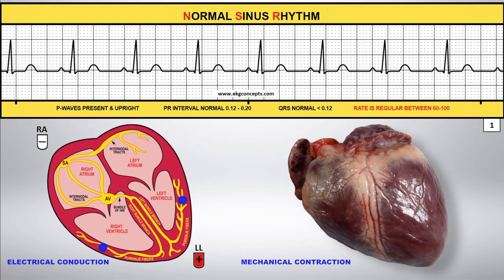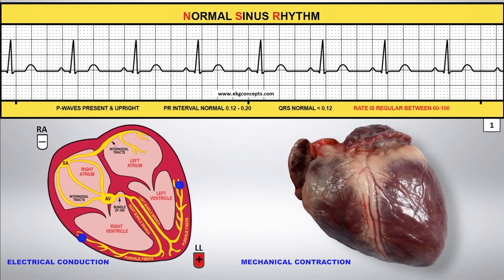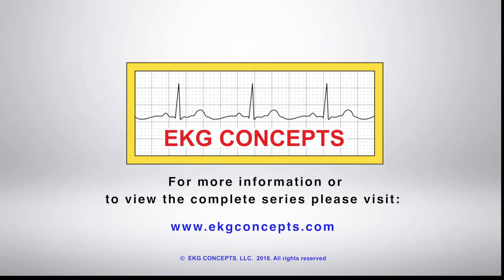In normal sinus rhythm, the electrical impulse follows the normal conduction pathways causing an upright P wave before each QRS. With every electrical conduction of the heart, we should have a mechanical contraction which gives us a heartbeat. Normal sinus rhythm is considered the gold standard by which to compare all other arrhythmias.